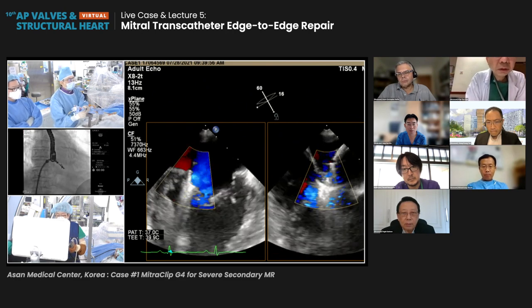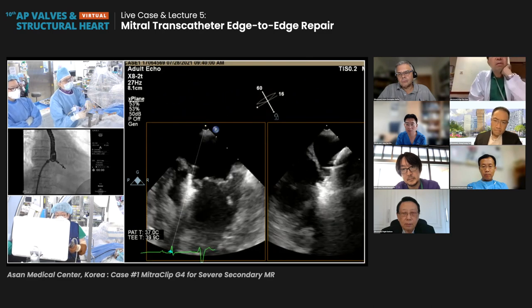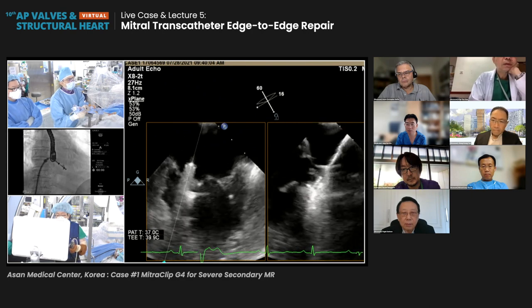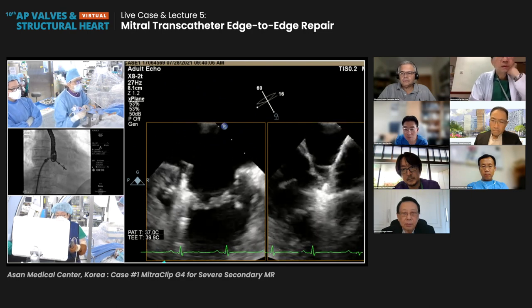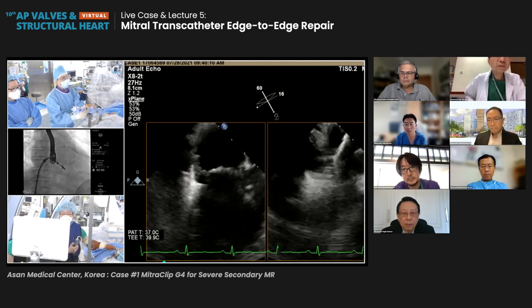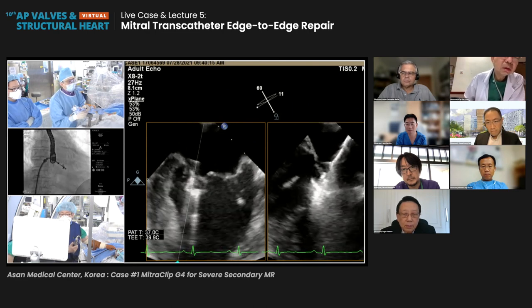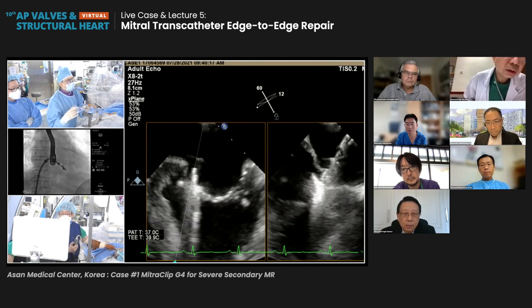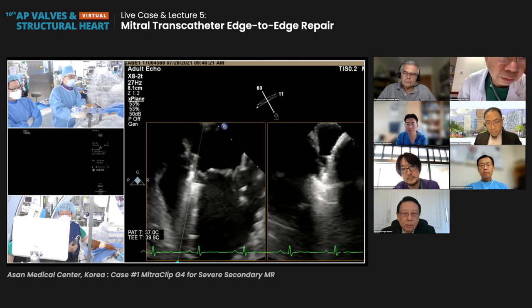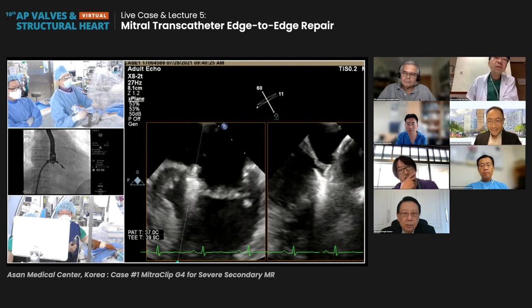Okay, but let's grasp here. Okay, this is the best position. Let's try the image like before, a little more. Unfortunately, this patient does not have a good echo window. Yeah, and imaging in the lateral position is always difficult. There is heavy shadowing from the echocardiographer, who must have a very strong arm. Okay, this is good.